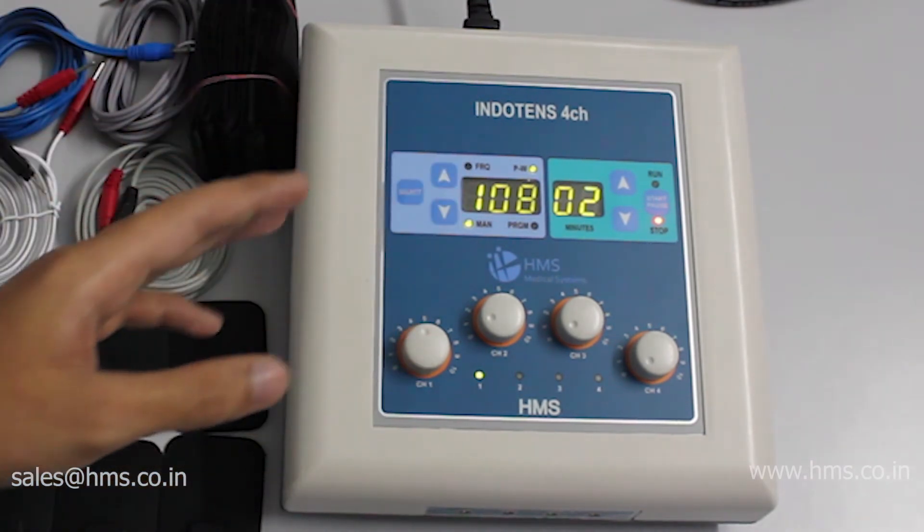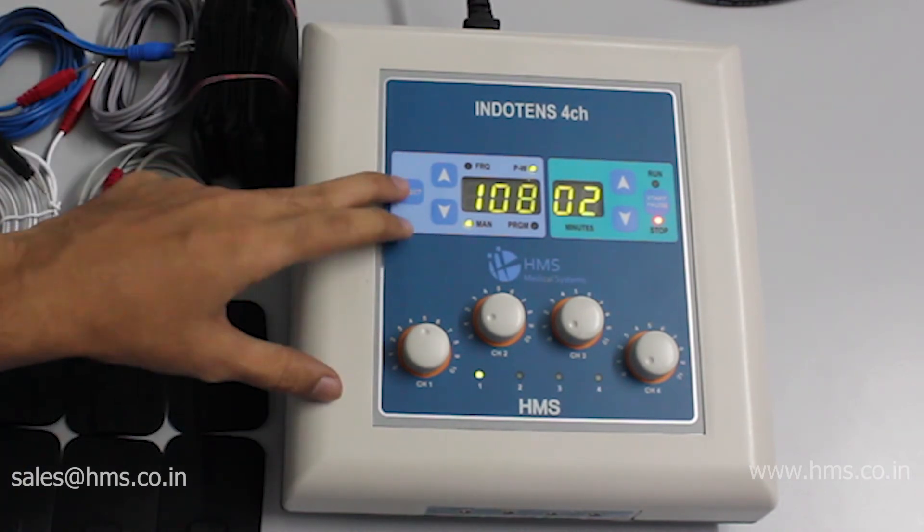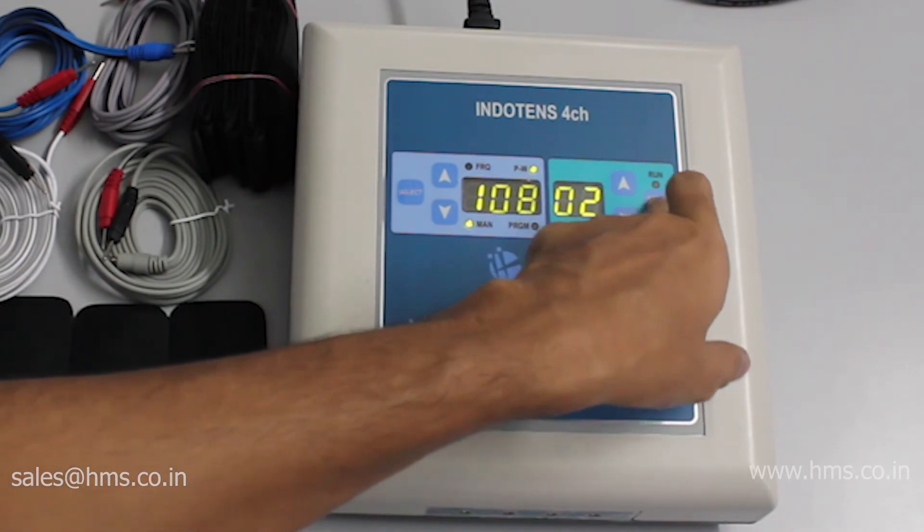This safety feature is also available on the basic model, the Indotense 4CH. Now let's go over the other pre-programmed programs available with the equipment.